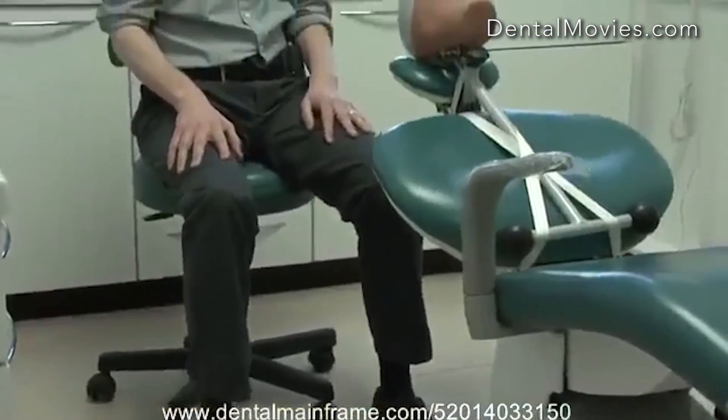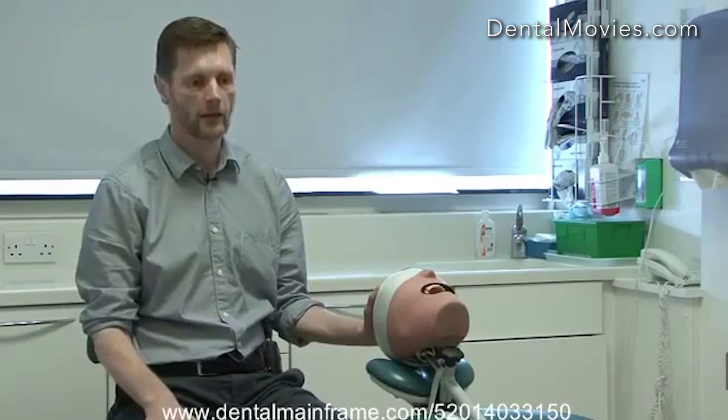Some patients won't want to recline this quickly, particularly if they're anxious. So it can be helpful in these situations to recline the chair slowly in stages rather than in one go, and often it's helpful to put a reassuring hand on the top of the head so that the patient doesn't get the feeling that they're going to fall out of the back of the chair.